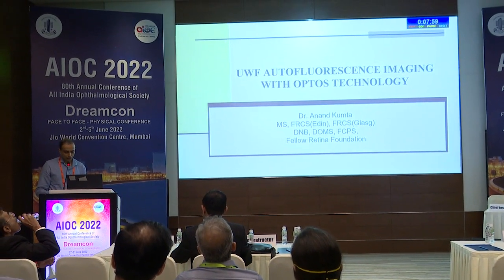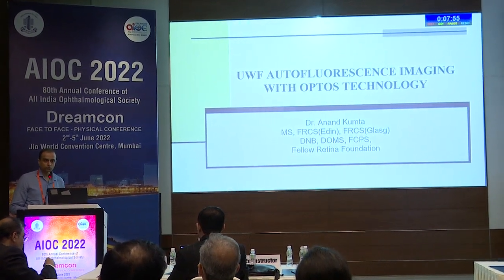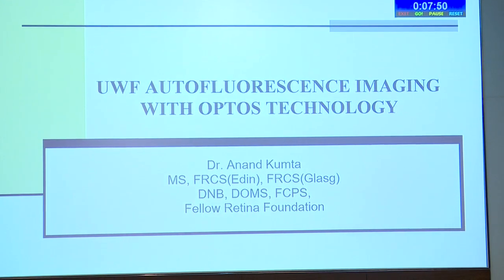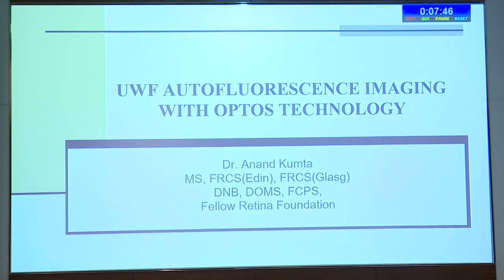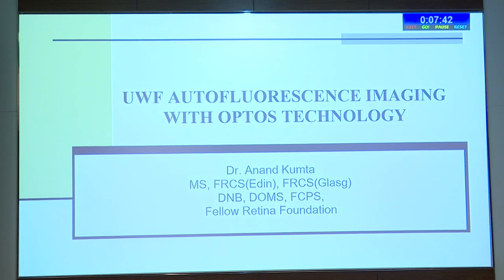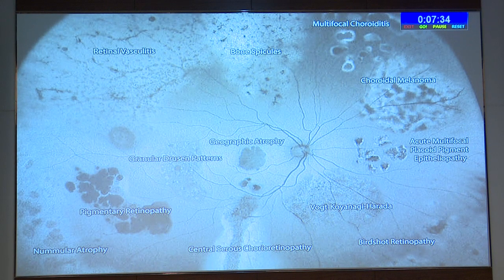I have had this technology for the last 2 years, but I wasn't using this modality, autofluorescence, until Dr. Nitin Prabhudesai asked me to speak on this, and I'm very grateful to him for that, so that I could start using this tool in my day-to-day practice, and I'll share my brief experience with this. So this is about autofluorescence, ultra-wide field autofluorescence imaging.